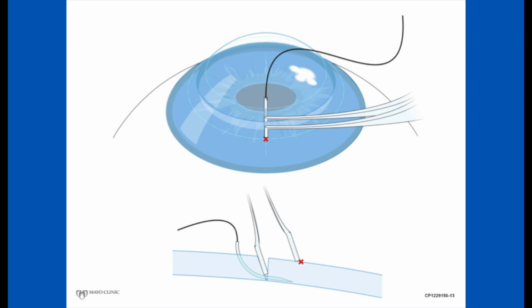Once you have that set up, the needle will drive accurately without any effort because there's nowhere else it can go. And once you have done that, you can look through the cornea and confirm that you are deep and radial and confirm that the needle is engaged the proper length relative to the wound margin. If the drive is a little long, one can just slide the needle slightly back through its passage until it is the length that you wish.